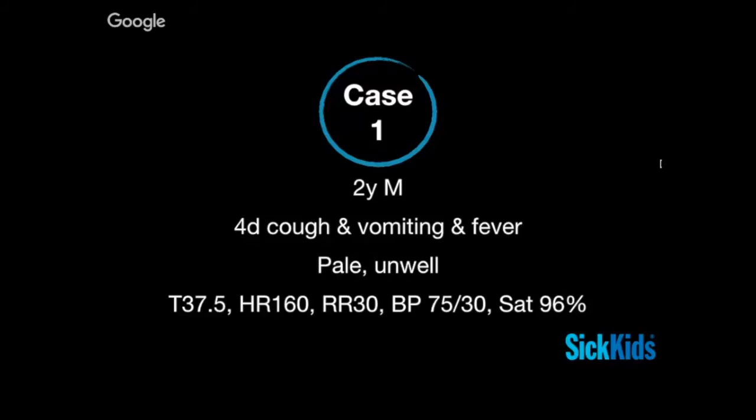And then you're called to the room for a sepsis alert because they actually look quite unwell. And they're not really febrile at the moment, but they are tachycardic and they are hypotensive, and their SAT on room air is 96%. And you're now a POCUS user, so you're going to apply your cardiorespiratory exam to them to try to figure out what is causing what.